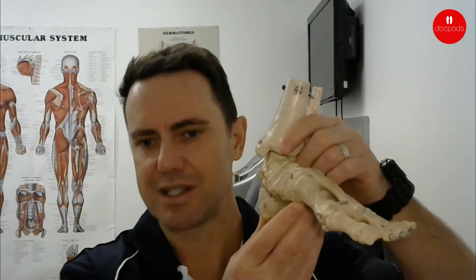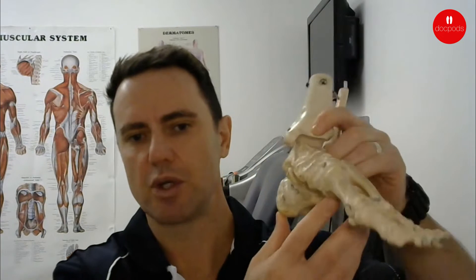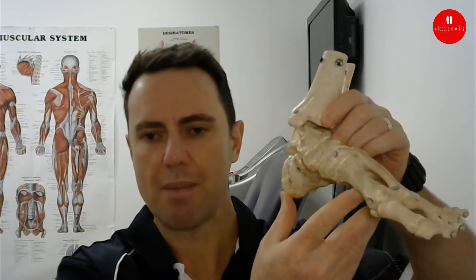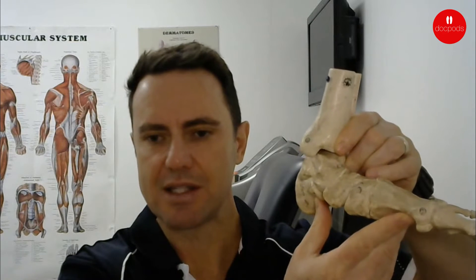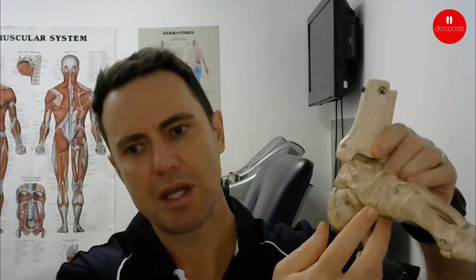We'll use overpronation as an example. This is a left foot. What happens in overpronation is the foot rolls towards the inside and the arch flattens out. You can see immediately that the gaps in the joints start to open up through here.